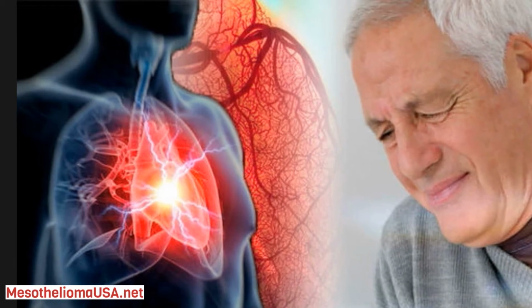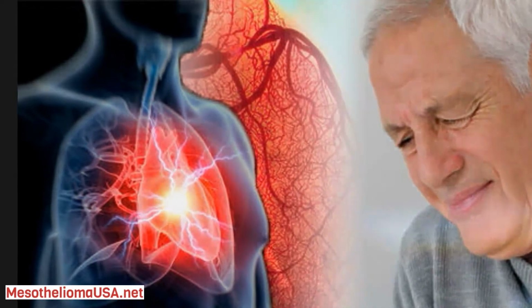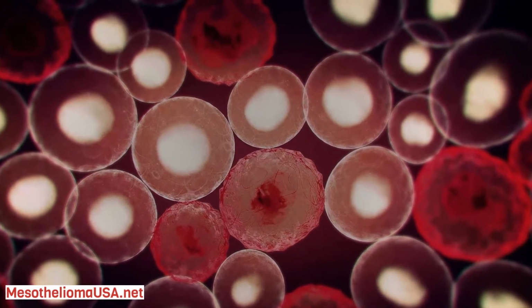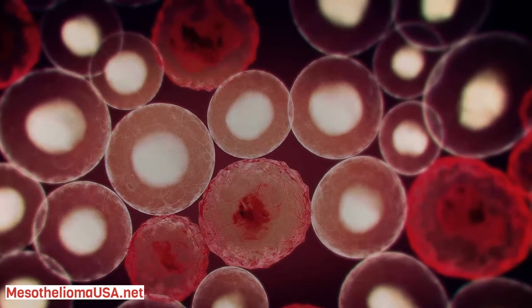In metastatic pleural disease cases, free pleural effusion, parenchymal infiltration, and pleural thickening were the most common CT findings, and invasion to other organs, pericardial effusion, and thickening had the lowest rate in this disease.